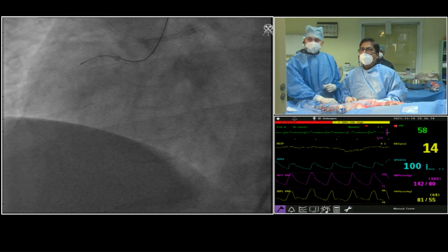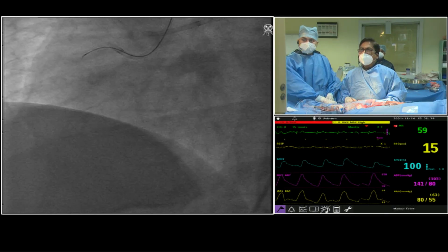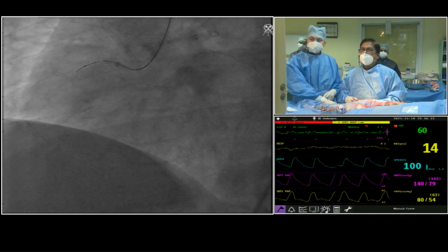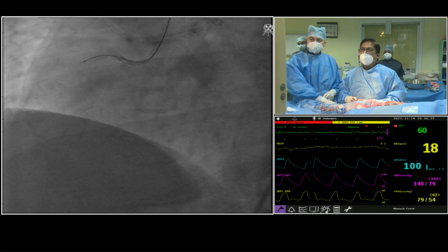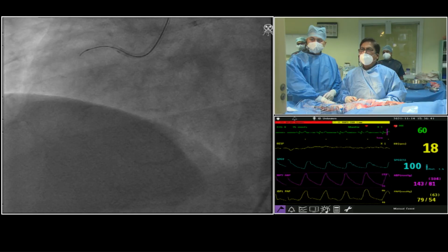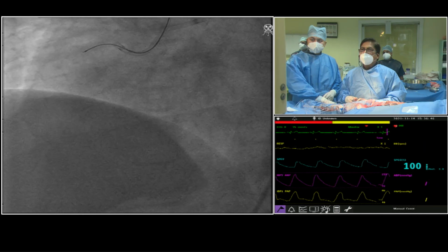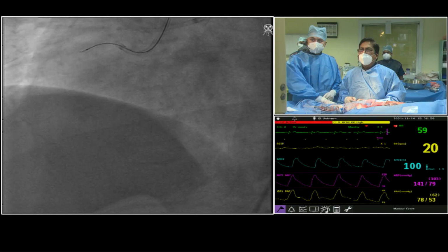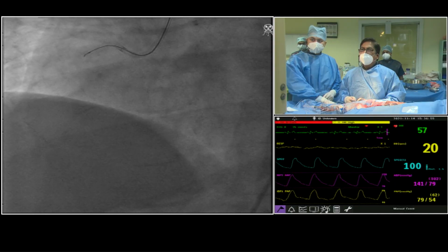Many cath labs do not have a SAL catheter all the time. But Dr. Goel is used to SAL and is very familiar with it most of the time. This is very important for an operator also. When he is familiar with something, that will be the ideal catheter. If you call AV Mehta, he will tell you, I will never use an XP catheter, only EBU, because XP and EBU you can use both together. But for an operator, comfort is also important, especially when you work in another lab.